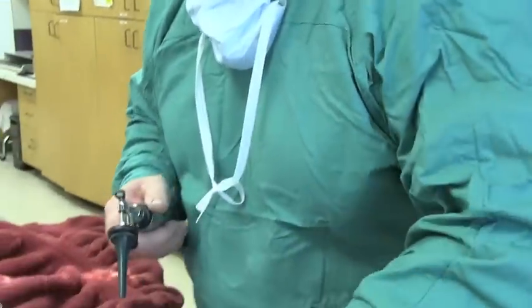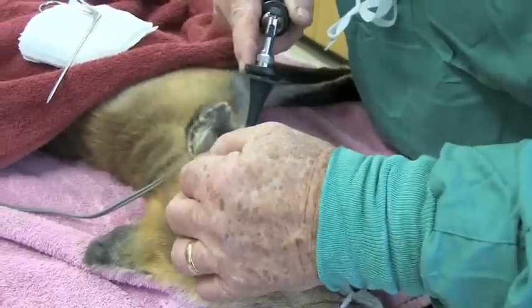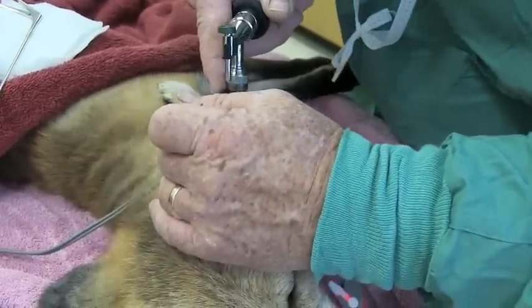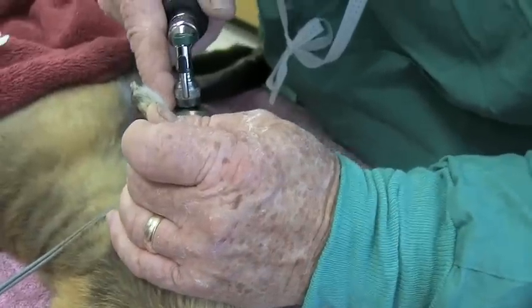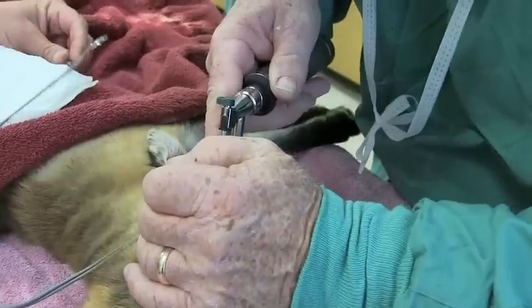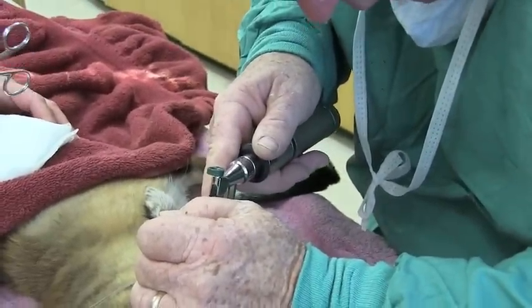We've discovered before we started filming that the fox had a foxtail, ironically, in its left ear canal. So what we're going to do now is look down into its ear canal and take that foxtail out if we can. I noticed there's a musky smell here. It doesn't smell like a regular dog. No, this is a wild animal, and they tend to have scent glands that are very musky smelling and different. It's kind of like a wild animal smell.